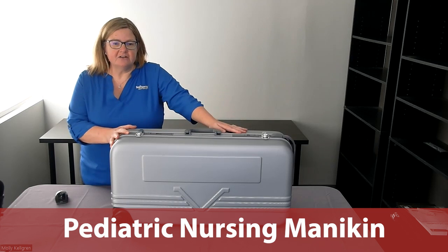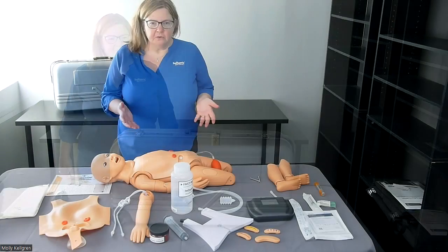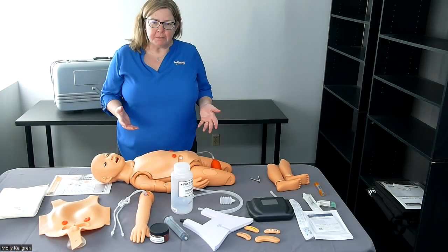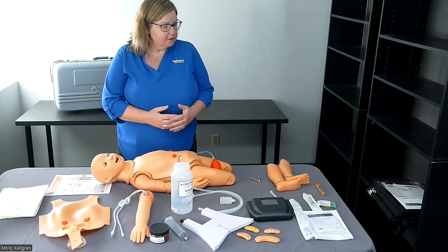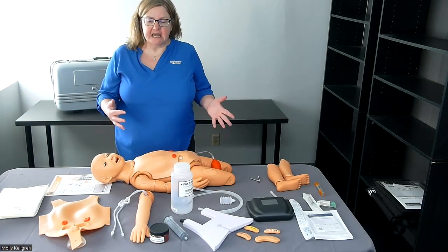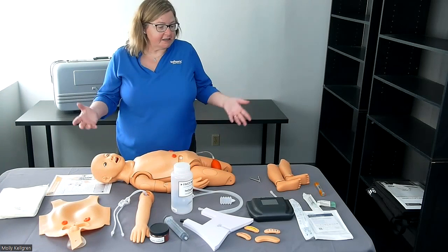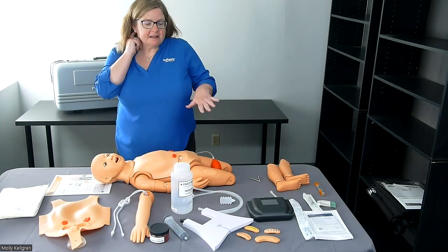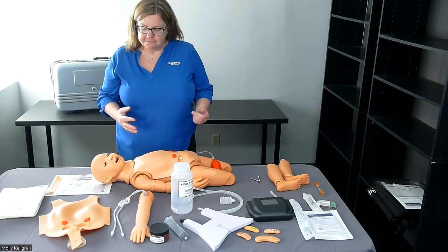This is how your pediatric nursing mannequin will arrive on site at your location. So let's dig in. Now that we have opened up our package and removed all the plastic and laid out all the components that come with the pediatric nursing mannequin, let's talk about them one by one. I can show you how to set up exactly what you need to do for all of the capabilities of the pediatric nursing mannequin.